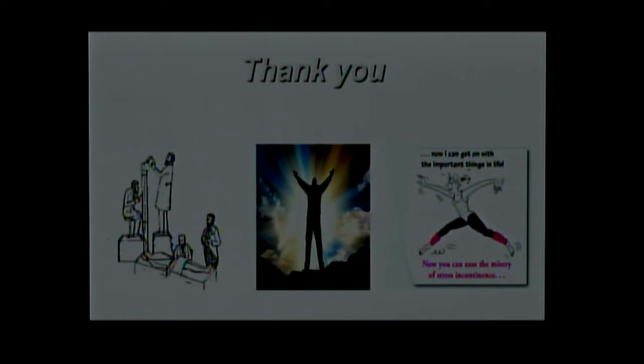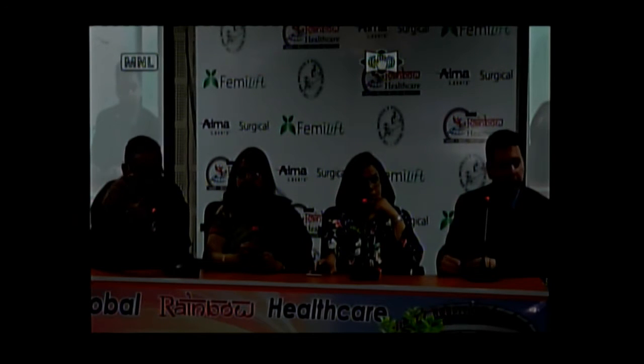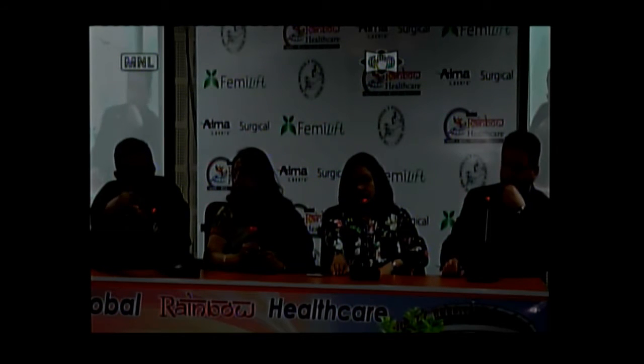It's an excellent tool. But I spoke about the outpatient solution. If outpatient, you could do other operative procedures with different handpieces. So for cutting, coagulating, burning the warts, you can attach this machine to a colposcope and do colposcopy, cervical biopsies, cervical conization. We can use the same through the laparoscope for laparoscopy, endometriosis fulguration, endometriosis cutting, cyst, fibroid. So it's a very versatile machine.